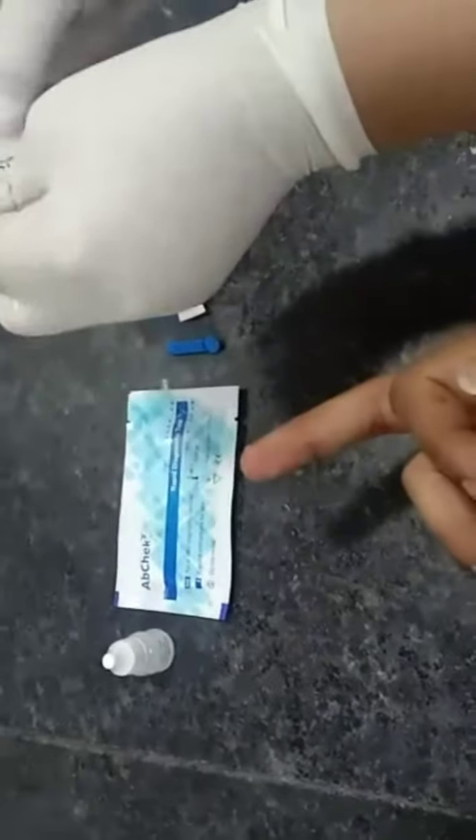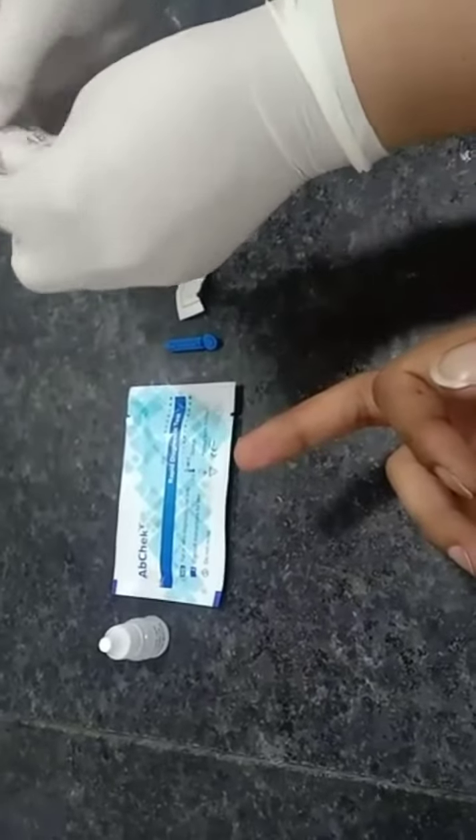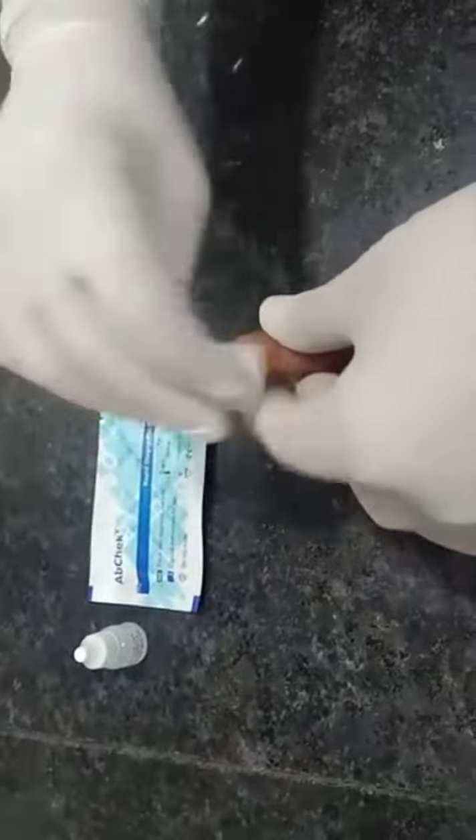Wipe the finger with the help of an alcohol swab. Let it dry. Then, with the help of a lancet, prick the finger.